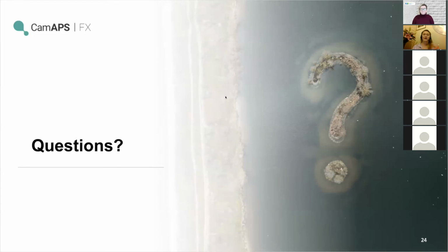So we definitely would recommend drizzling in carbs rather than front loading pre-exercise. And there will be some forms of exercise where actually turning auto mode off and putting the pump in a really low reduced temporary basal is what you need to do, because you're going to run a marathon or something.